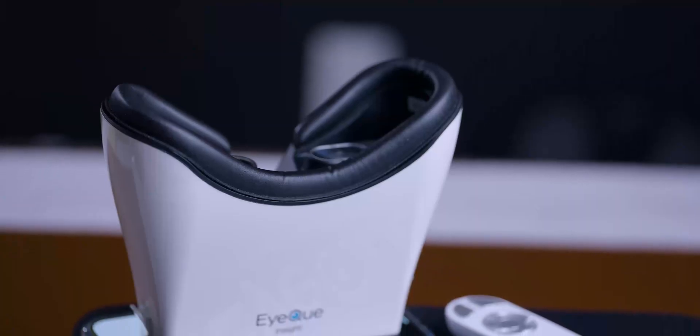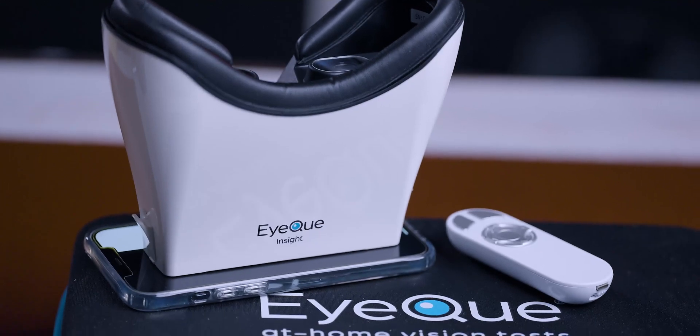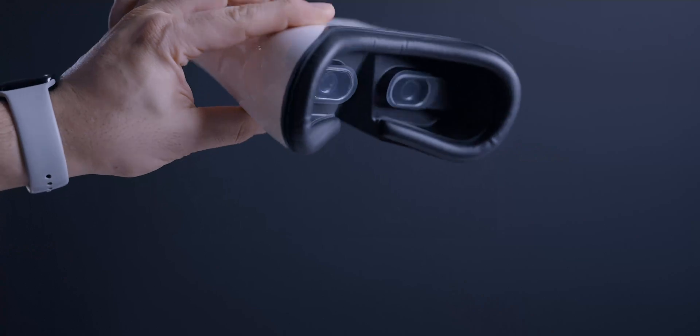Technically you don't need the big bundle to order glasses. The additional device basically tests if you're seeing 20/20 in less than a minute, and also checks for color deficiency or contrast sensitivity.